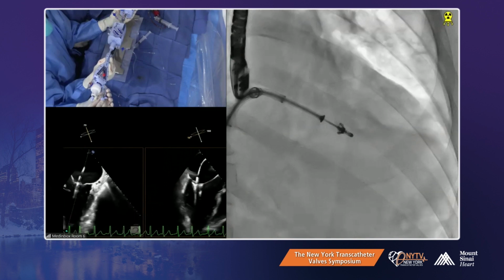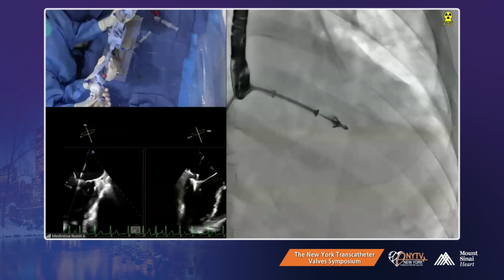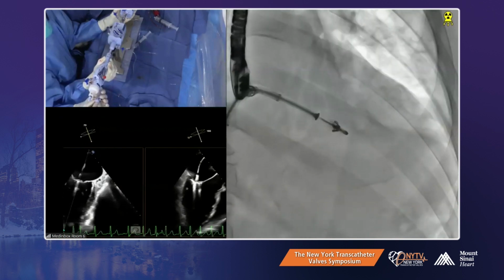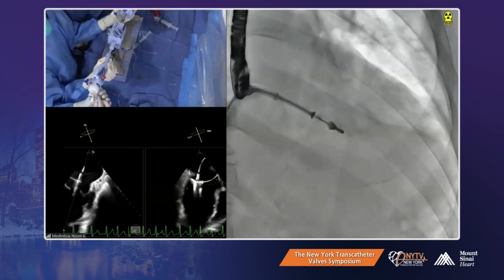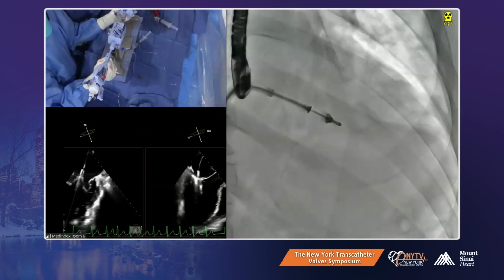I think you have it there. Why don't you drop the gripper there? We're gonna go in now. I don't know if we have enough. That was your point earlier, right, Howie? Yeah, but this looks okay. Okay, go down. Close it and see if we see gripper bounce. That's the only concern.